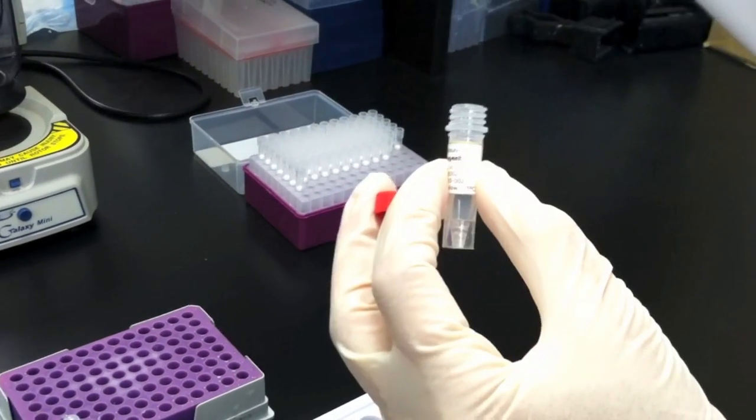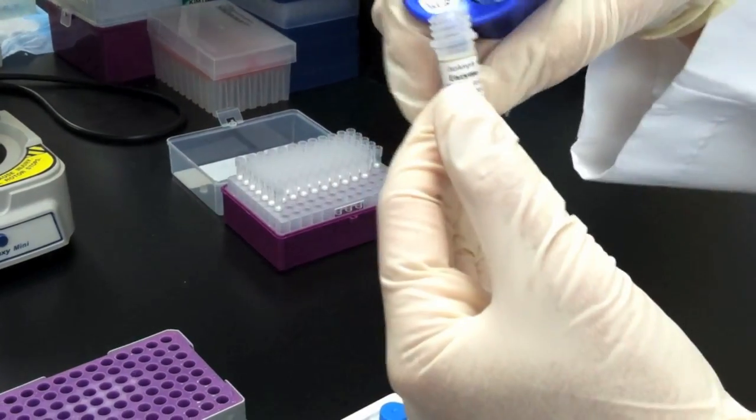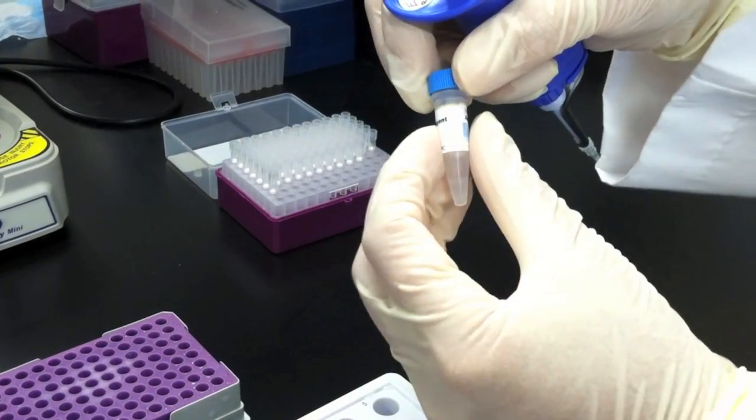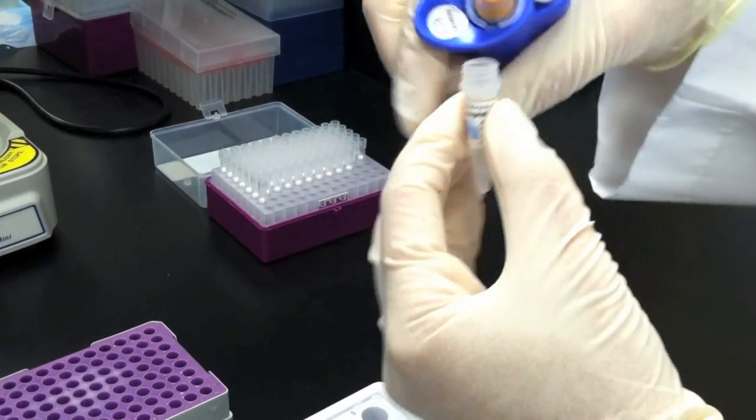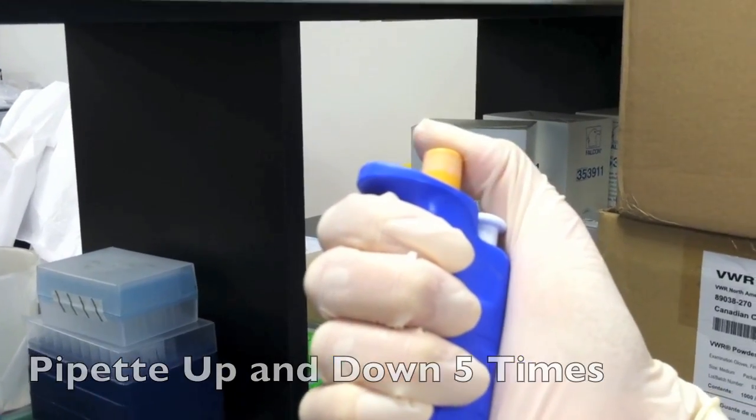Prepare the master mix by transferring 25 microliters of enzyme reagent, the red cap, to the amplification reagent tube, the blue cap. You must mix the solution thoroughly by pipetting the solution up and down at least 5 times.